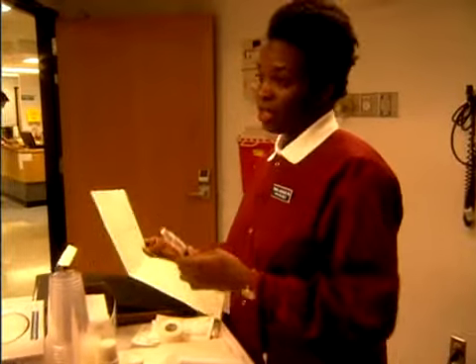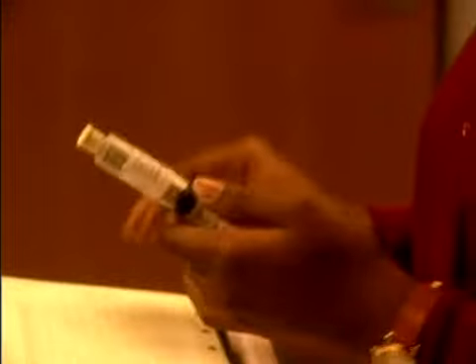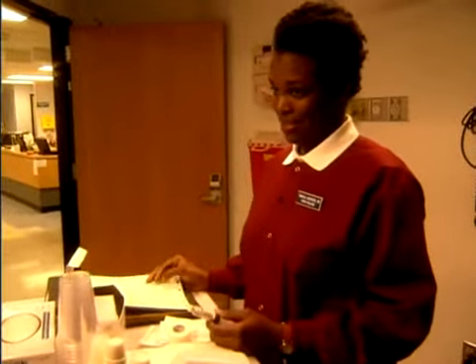Keep going. You're doing fine. Okay. So I read the MAR and retrieve the patient's medication from the patient's drawer and compare the label on the medication with the MAR. That's check 2. I'm going to infuse it over 30 minutes, which is the prescribed infusion time. Compare the information one last time. And that's check 3. Then we're off to see the patient. Here we go. Good job.